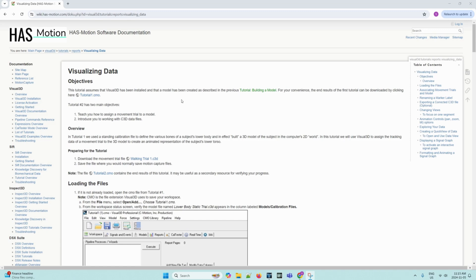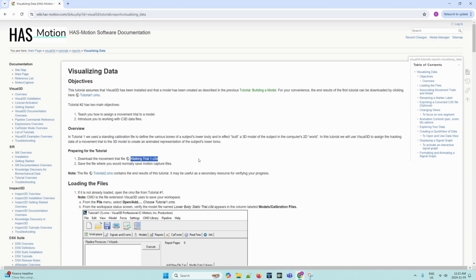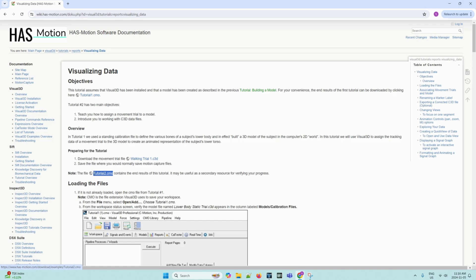To prepare for this tutorial, we must first download the movement trial file named walkingtrial1.c3d. This is available on the tutorial page on the HasMotion Wiki website. You may also choose to download the tutorial2.cmz file, which contains the end results of this tutorial. This would be useful as a secondary resource in verifying progress.